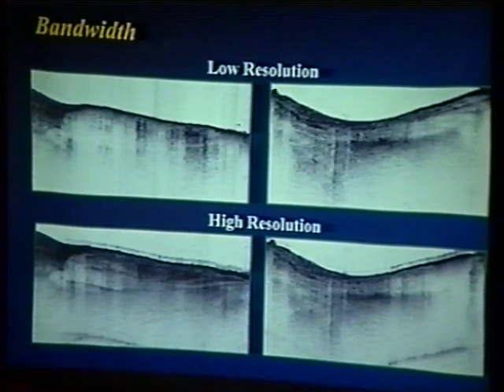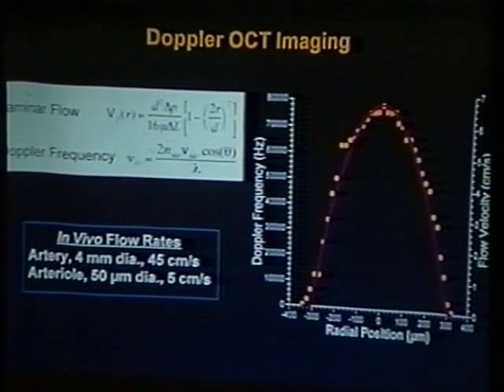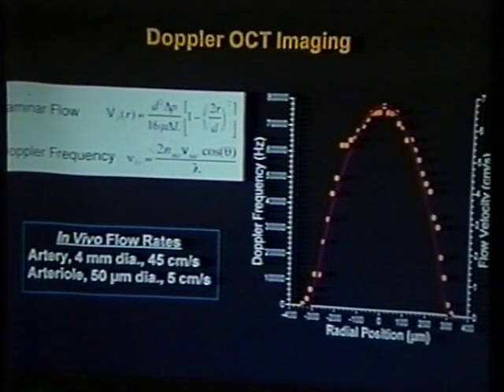Now, the things that are attractive about this are, we need a phase delay, that's how we eliminate our 1 over F noise, it's basically our carrier signal, and where this light shines relative to the axis of the mirror controls the phase delay. The group delay is controlled by the angle of the mirror, and group velocity dispersion, which is important with light, can be controlled by controlling the distance of this lens from the mirror and the grating. So it allows us to control that without the addition of a prism.